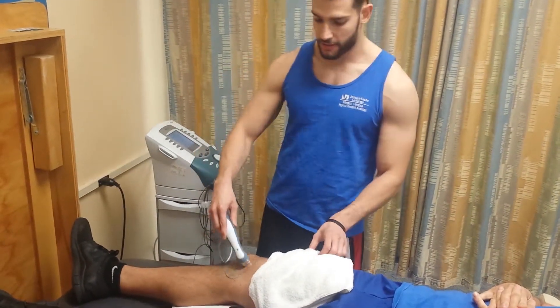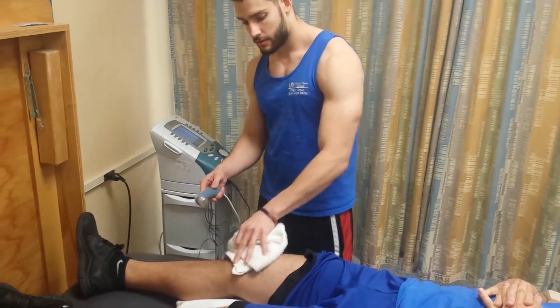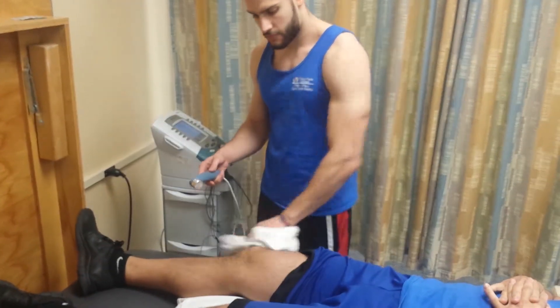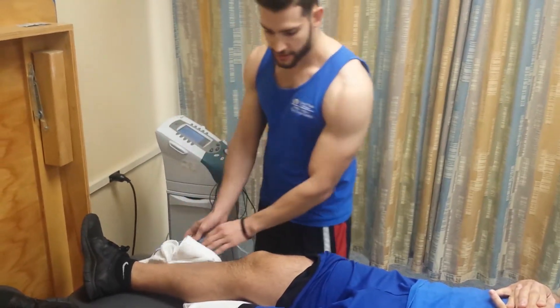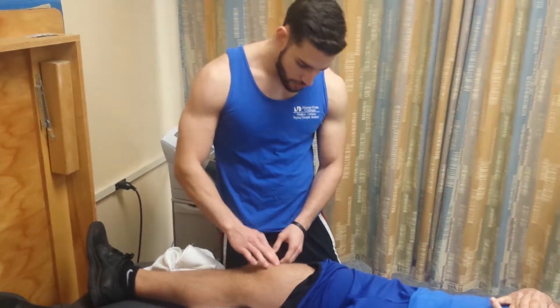So once the machine shuts down, you can remove the ultrasound head and clear the gel off. Then reassess the area for the patient. Everything looks normal.